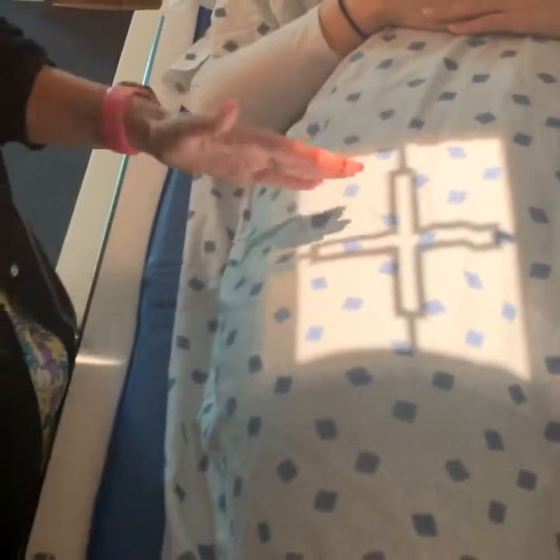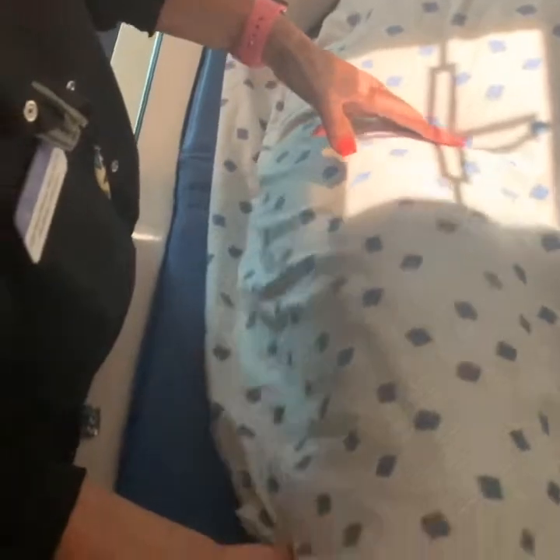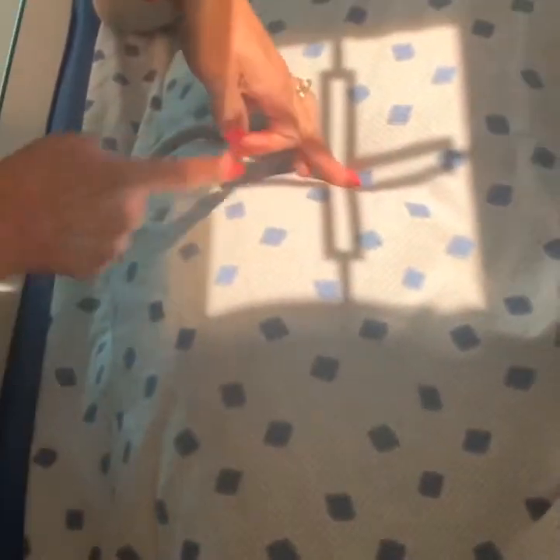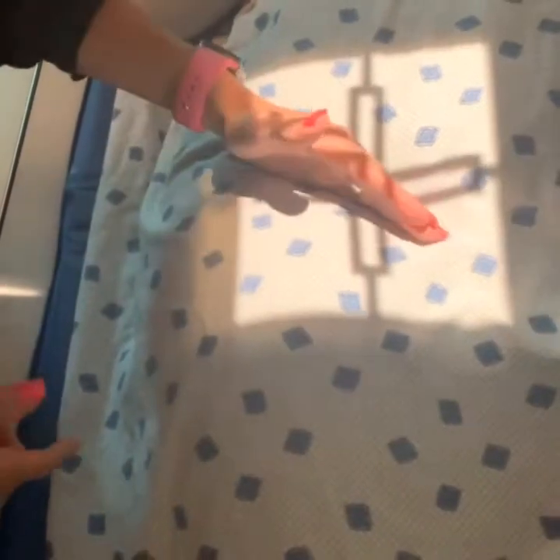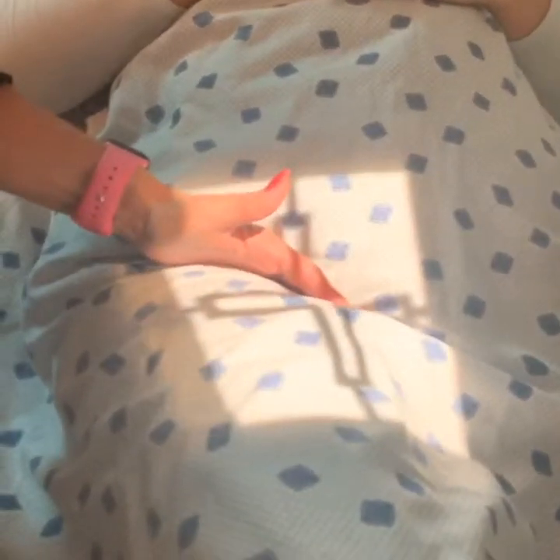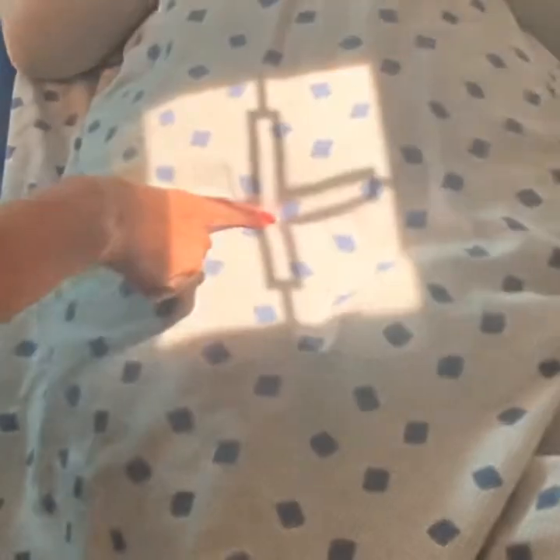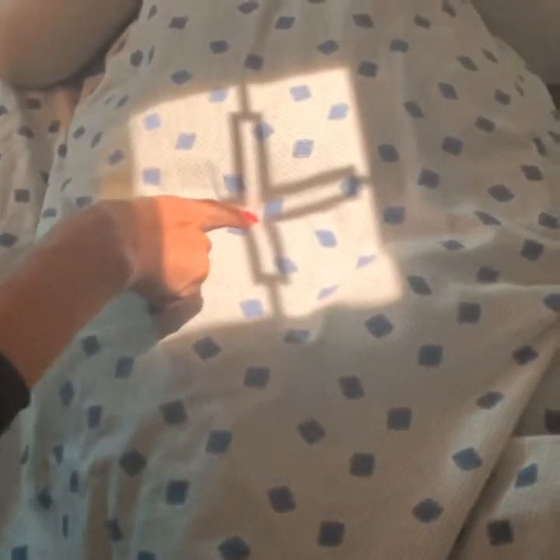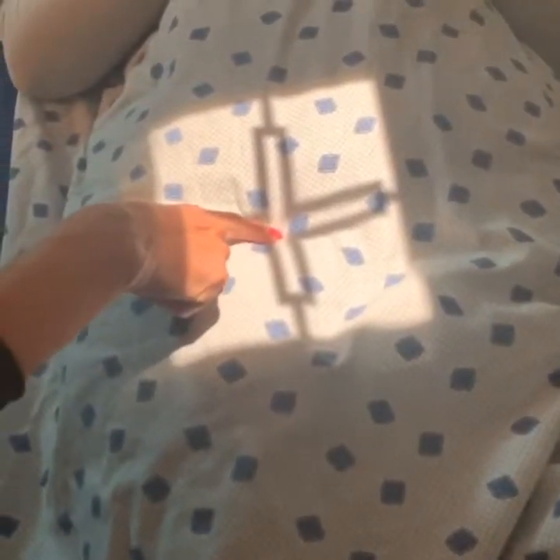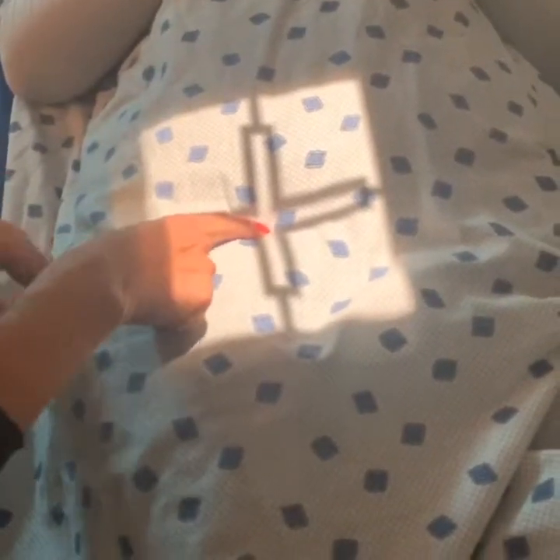Now the cheat that I'm gonna tell you, you can relax your leg for a second. Typically, if you bend their leg, straighten it, you end up right in the crease of the hip. Like literally, this is where her hip crease is. Bend. My hand is cupped right in the crease. And that's typically right where you end up, which is, if you think about it, when you bend the knee and you bend the hip like that, that's exactly where you are, right in that femoral neck region.